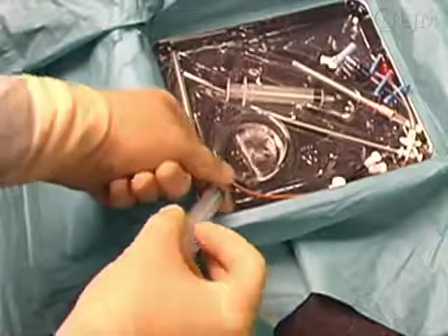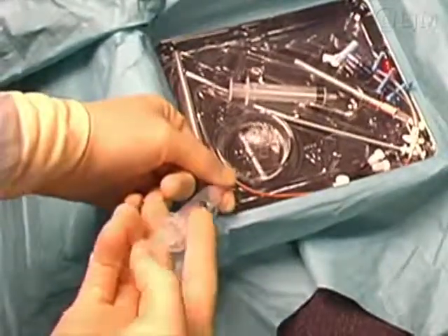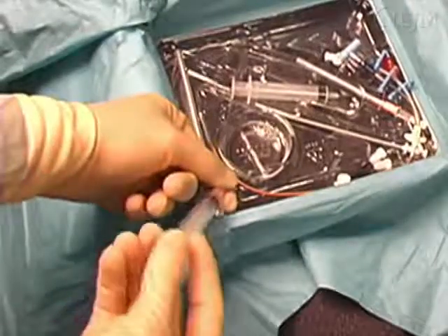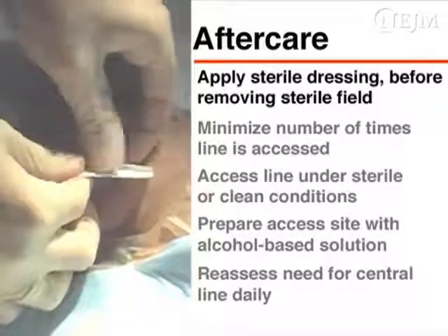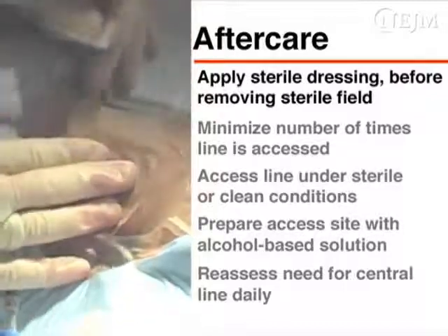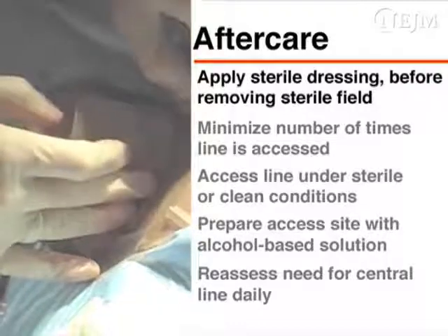In this circumstance, remove the needle and flush it thoroughly with saline to clear it before reattempting placement of the line. A sterile dressing should be placed on the insertion site. The dressing should be changed daily, and whenever blood or liquid accumulates or it loses its seal.